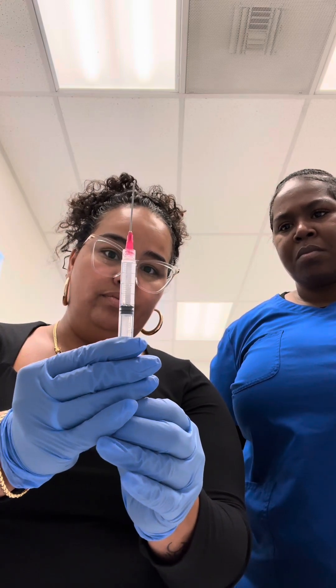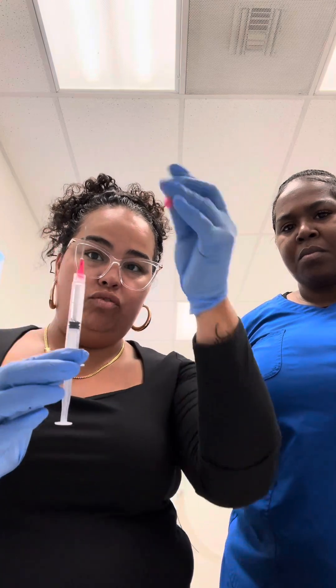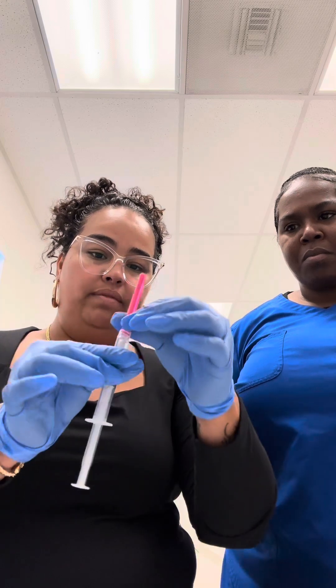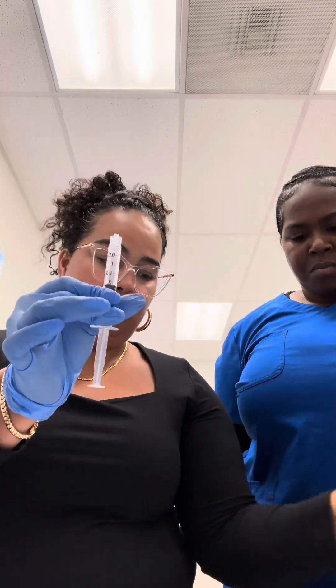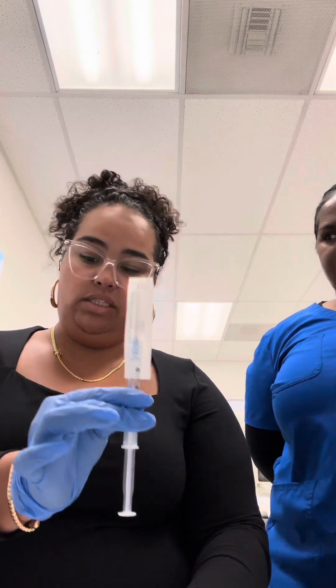Push the air out. You're going to recap — don't recap like this. Lay it down and do the scoop method to scoop your needle. Be very careful. Then you unscrew it. You can do a few taps to get those last bubbles out. I prefer you just pop it like that and attach the new needle. The doctor knows exactly what needle to use — don't ever go based on colors, as colors change based on manufacturer.